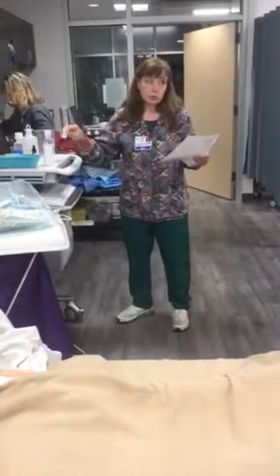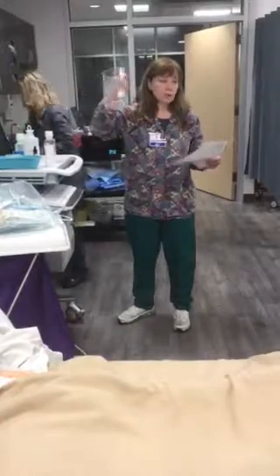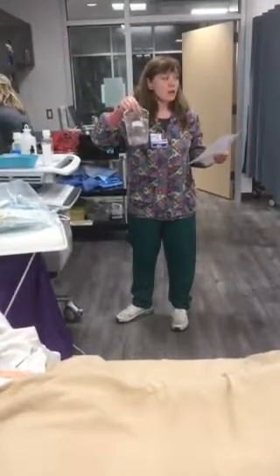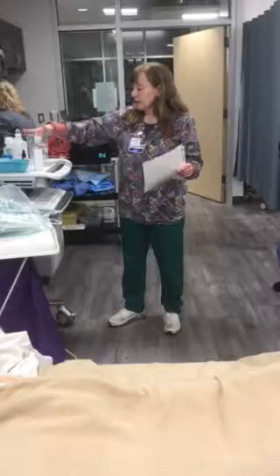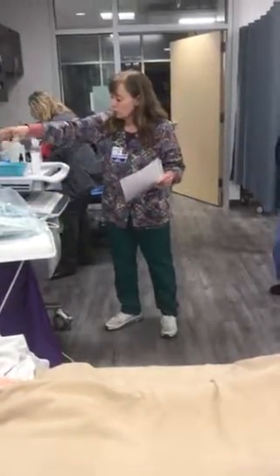So just grab two labels or so. We'll probably pre-label these to help save time. And when I'm doing your checkoff, I want all the labels done before you come up. You'll need at least two of these, one for the feeding, and one for the water.